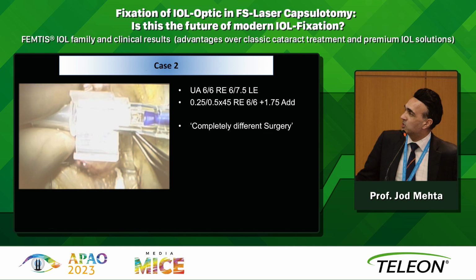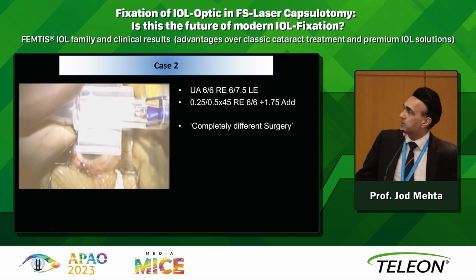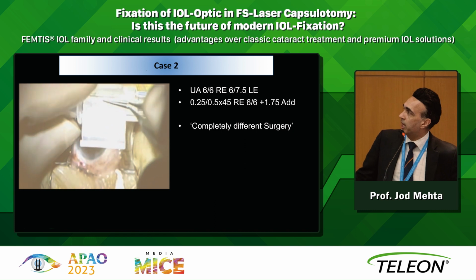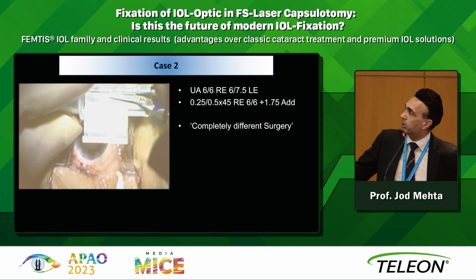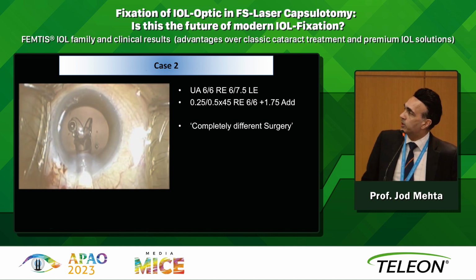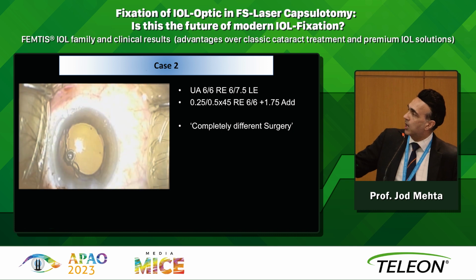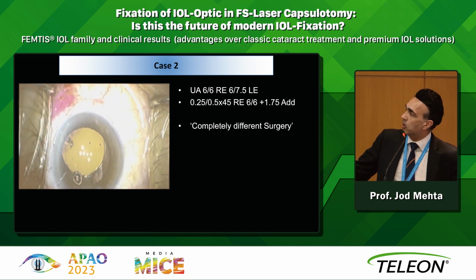I do this on every case. I think it's worthwhile doing it as a routine thing to make sure you've got the flanges in the right position. It only takes a minute to check. The lens nicely sits in this pocket. Make sure you've got a good amount of viscoelastic over here so it doesn't get caught up with the injector. Again, inject and then just wait and allow the memory of the lens to open up.